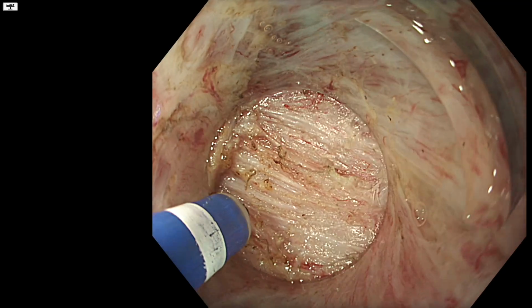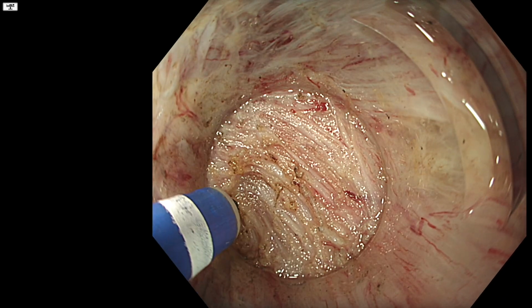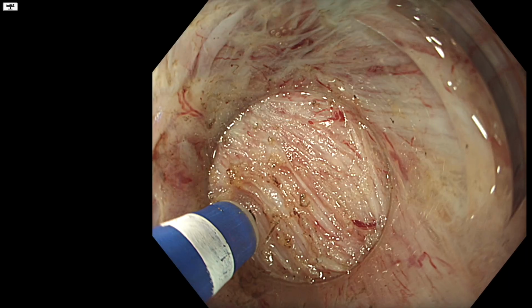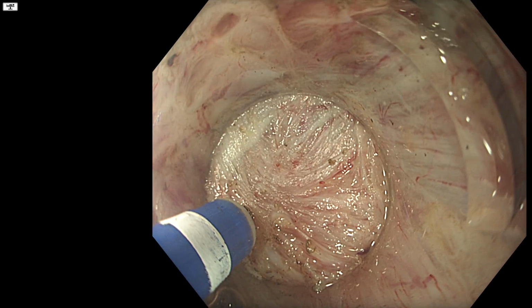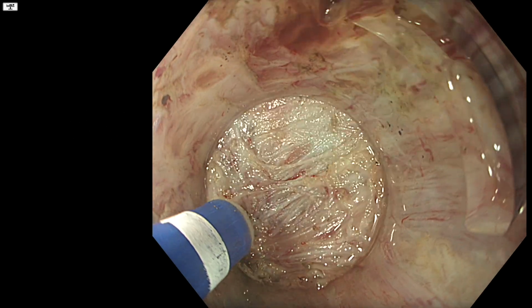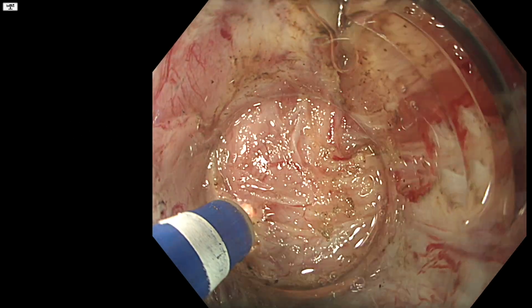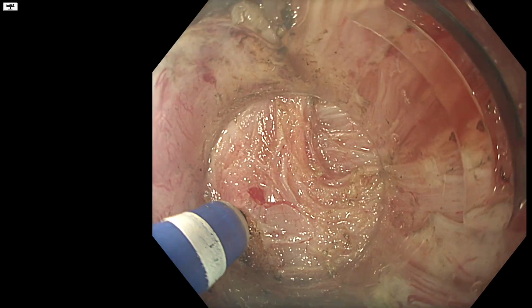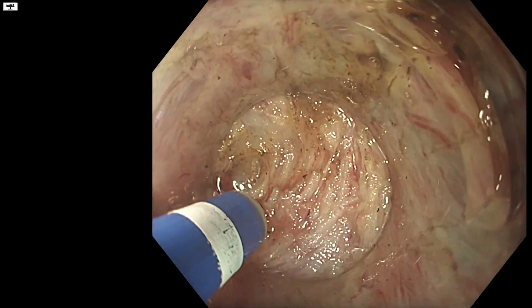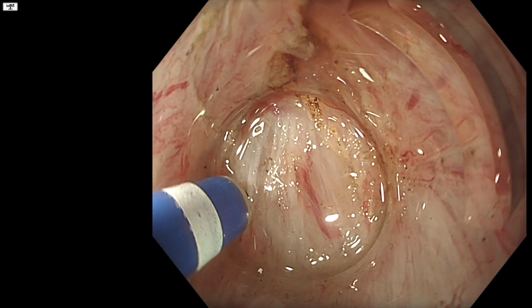But I do want to emphasize something which is equally important. EID should be understood as both a therapeutic and a staging procedure. Among all the completed procedures in that same series, 16% revealed non-invasive or SM1 histology, meaning that EID actually overtreated these cases, and conversely 31% showed pT2 or deeper invasion.